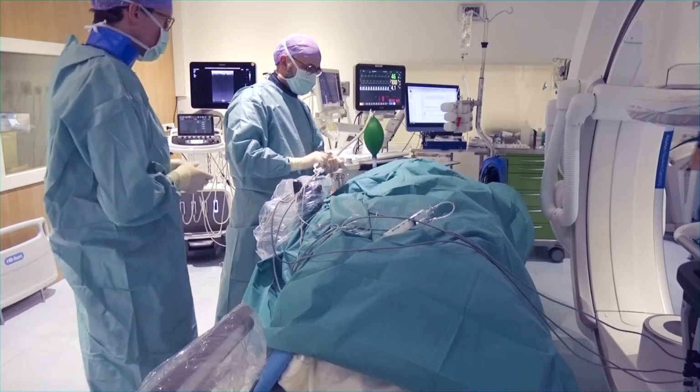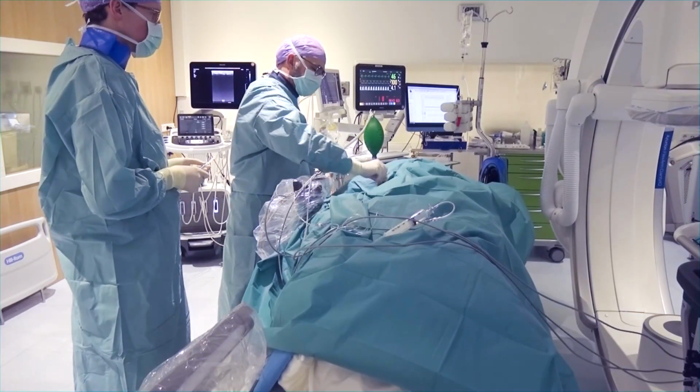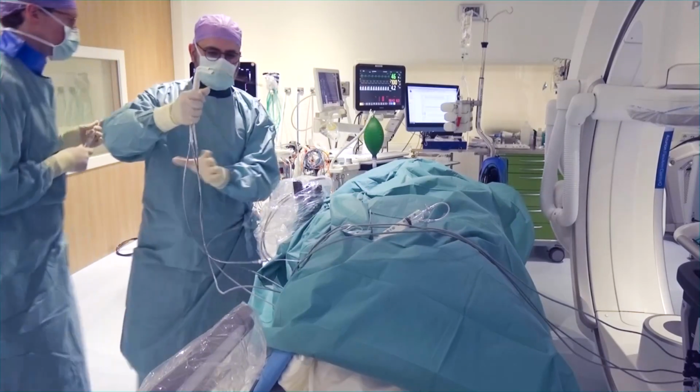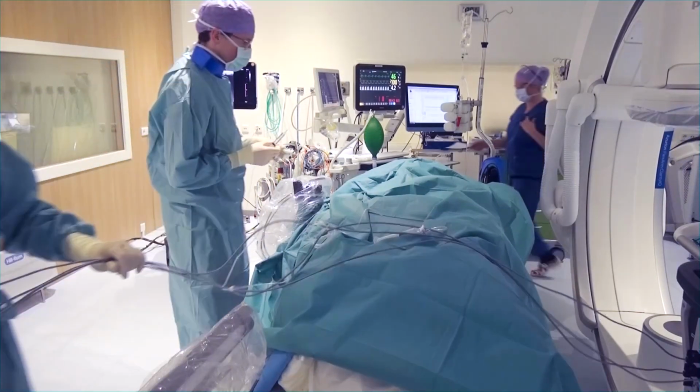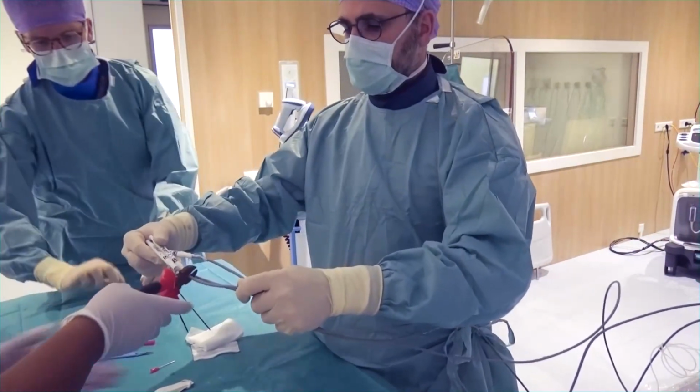The small skin incisions are then taken care of and small dressings are applied. The needles are disposed by cutting off the steel wires with a special plier.